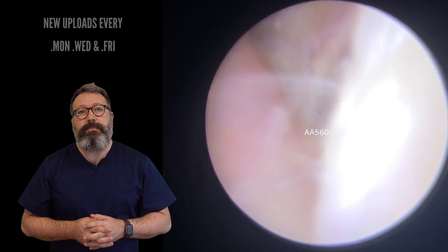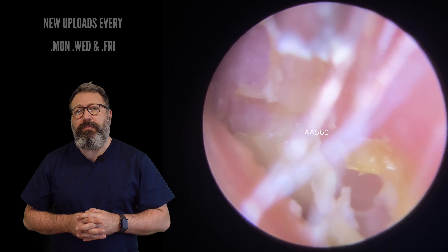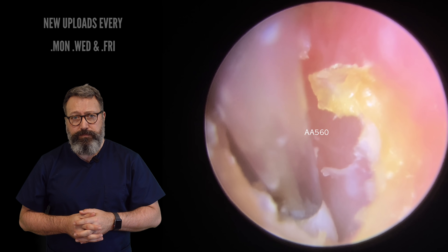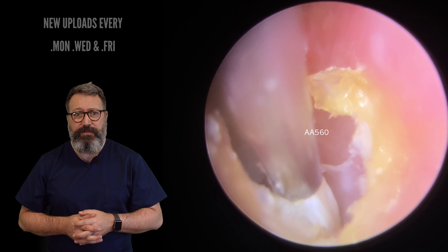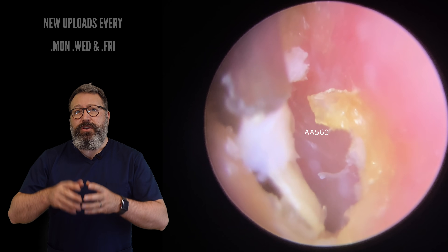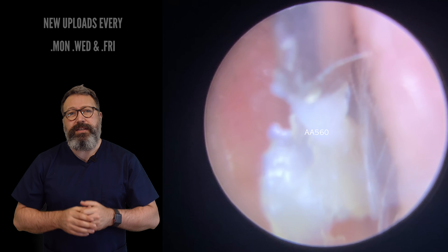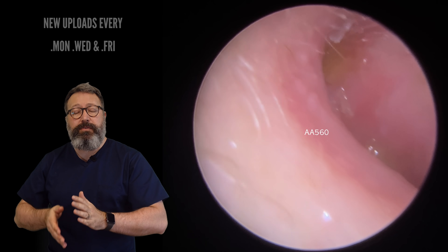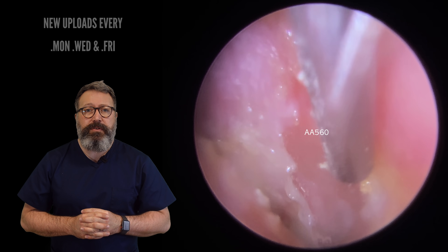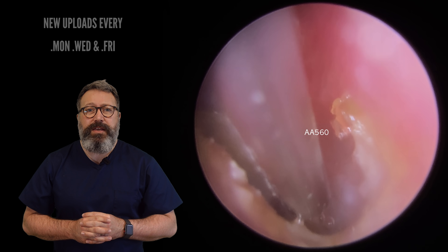Potentially you could cause a perforation to the eardrum if you're not very careful here. There's just a little bit of wax on the outside part of the ear. Very gently teasing this away. When we work the olive oil in there, it's going to get between those layers of skin and it's going to come away a lot more easily. You can see I'm working this dead piece of skin here from the base of the canal — out that comes. You can see it's this long kind of sheet of skin that comes away, and this is what's building up — layer upon layer of what you just saw me take away there. So this is the olive oil going in now.